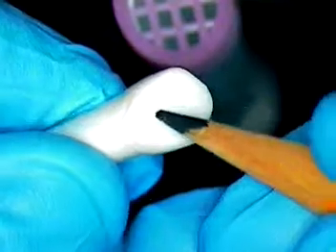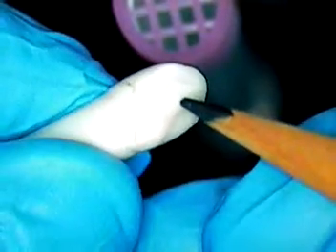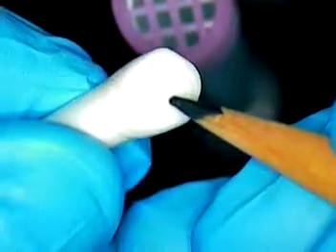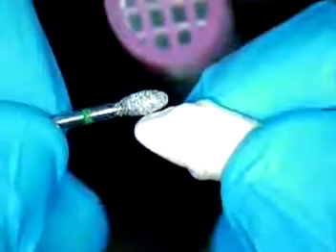Let's score those areas and do our depth cuts for the three-plane reduction and see what happens. The last part is to reduce the lingual — you can take half the diameter of the burr to get about 1.25mm reduction. There's another drill bit called the football diamond, and we'll reduce that lingual portion with the football diamond. So it'll look like this when we're done.